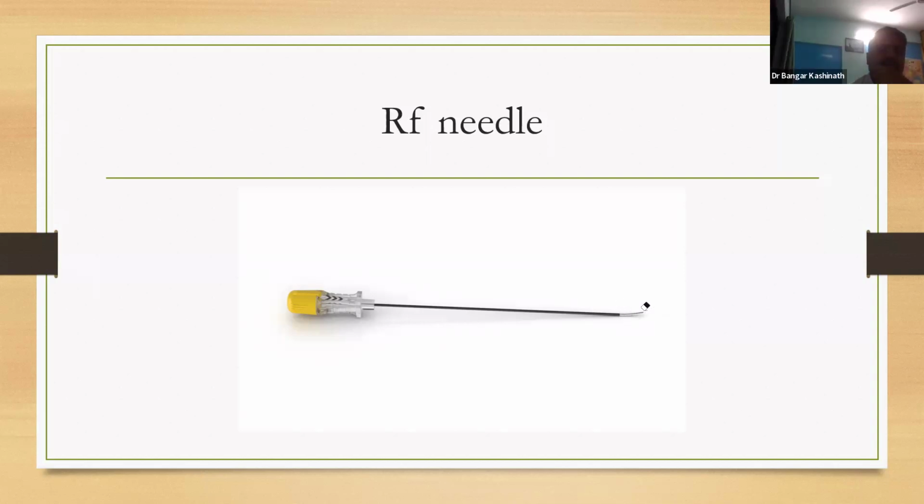Fantastic. One more thing about the tip. Here it is curved. So it can be straight and curved as well. Correct? Right? Sterilization? Pre-sterilized. Just go and check the pre-sterilization. Most of the instruments are pre-sterilized.